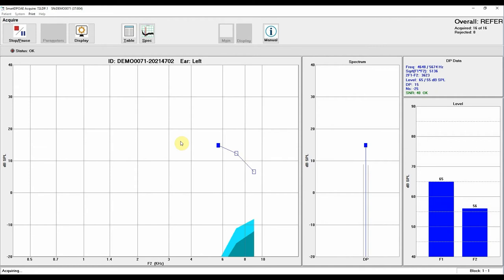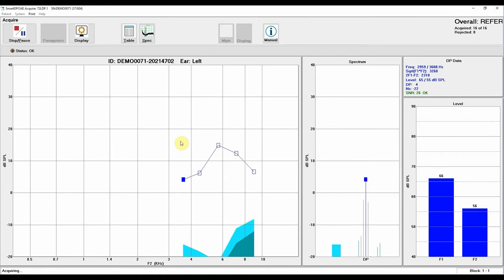Once the test is complete, move the probe to the opposite ear and select the corresponding test ear button to initiate the test again. When testing is complete, click on the Display button to display side-by-side results for both ears. You can view the data table information for each ear and print the results with or without passing criteria.